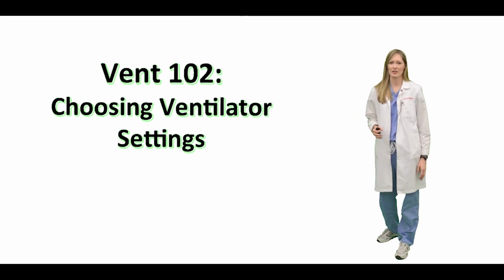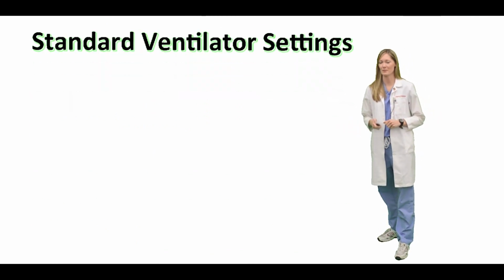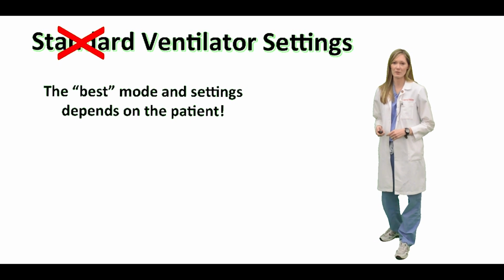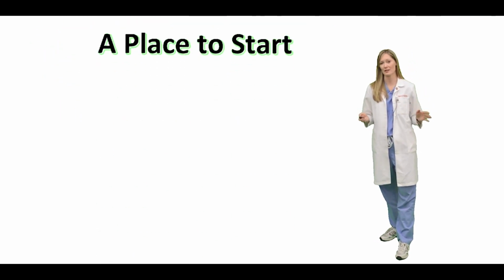You may be asking yourself, can you please just give me some standard ventilator settings that'll work for my patient every time? Unfortunately, I can't do that for you because there's no one-size-fits-all in the ICU, so no best mode that's going to work for every patient. But I'll help you out. Let's have a place to start.